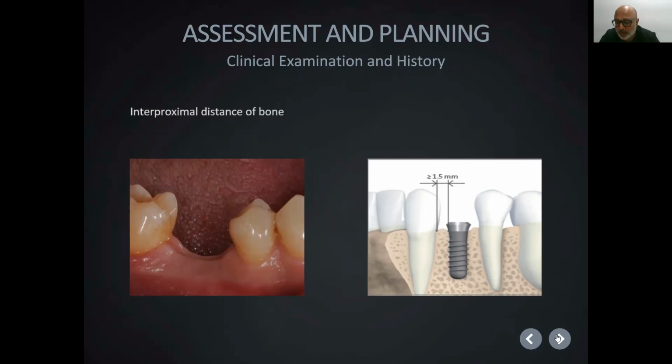Just for those who want to know, I use the BLX system, which is not one I recommend for people starting out in implants. I usually recommend the BLT, mainly because the BLX is far more aggressive, which I like in my hands. I think I get great success out of it.